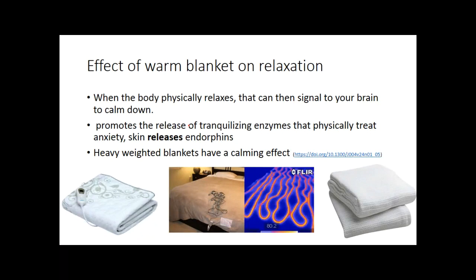This is science-backed. Providing warm blankets will make the body of the patient secrete tranquilizing enzymes, which will make them relax. This is good for adults and pediatrics.